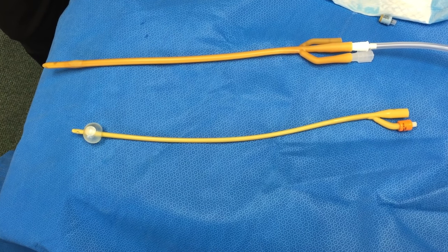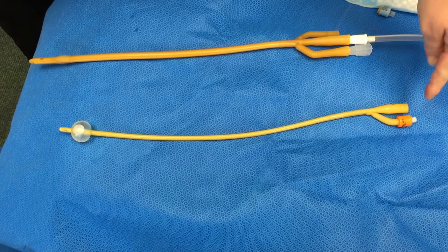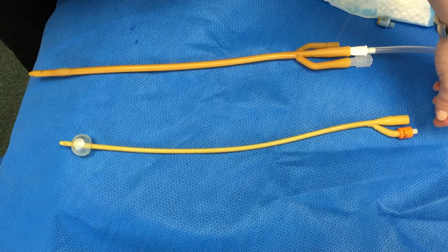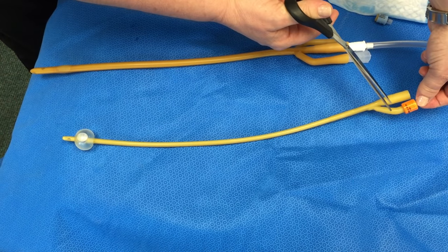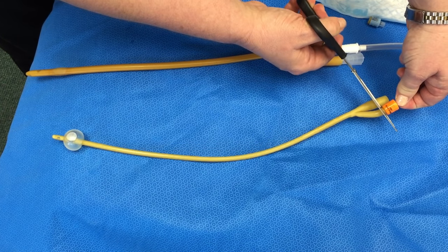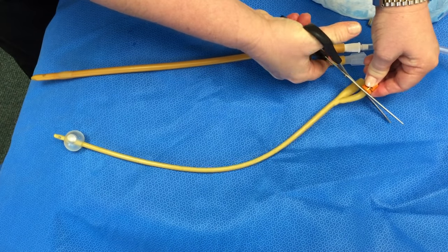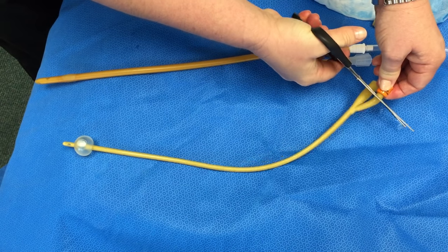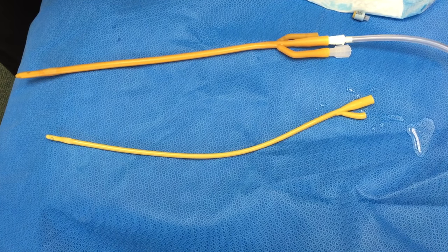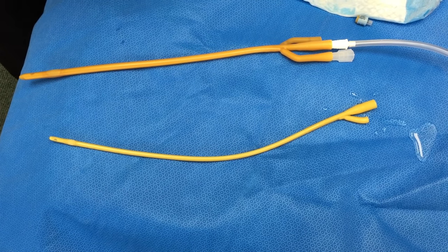We're going to demonstrate that again on the other catheter here. The balloon port is identified and it is transected right at the area below the colorful cap. Sterile fluid will come leaking out, and as that fluid leaks out, the balloon will deflate. Wait about a minute and you should be able to glide it out of your body without any resistance.